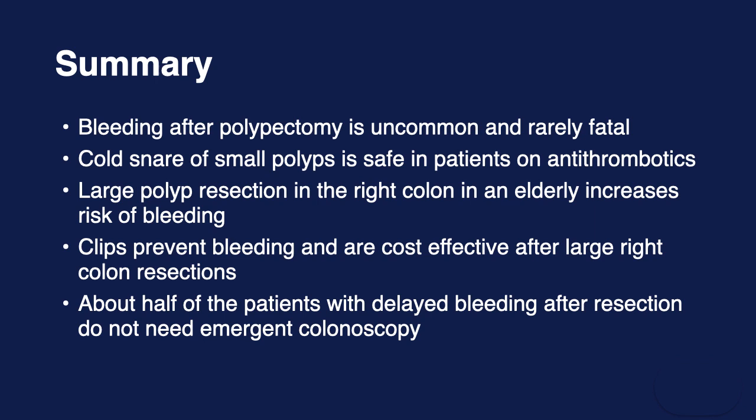In summary, bleeding after polypectomy is uncommon and rarely fatal. Cold snare of small polyps is safe in patients on antithrombotics. Large polyp resection in the right colon, especially in the elderly, increases the risk of delayed bleeding, and clips prevent bleeding, and also clips are cost effective after large right colon polyp resections. If patients come back with delayed bleeding, about half of the patients do not need emergency colonoscopy.